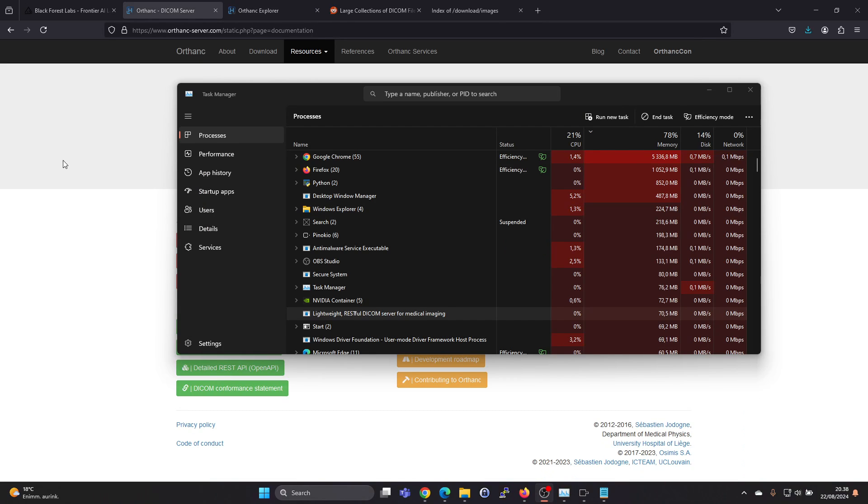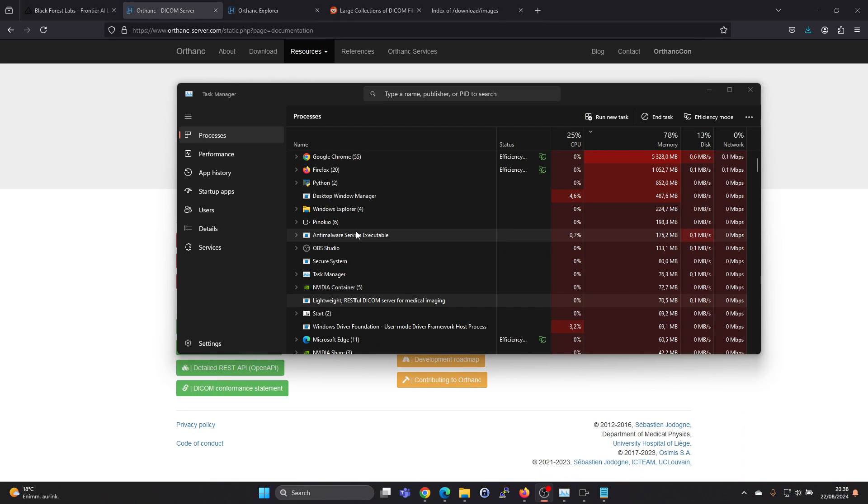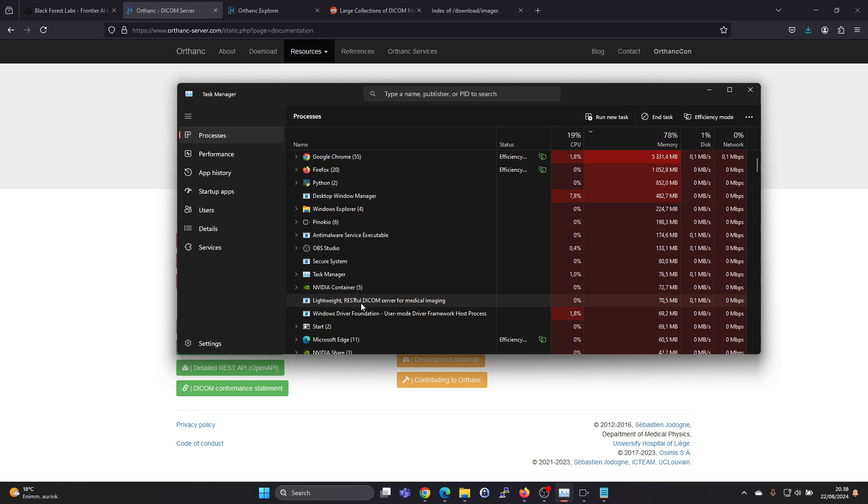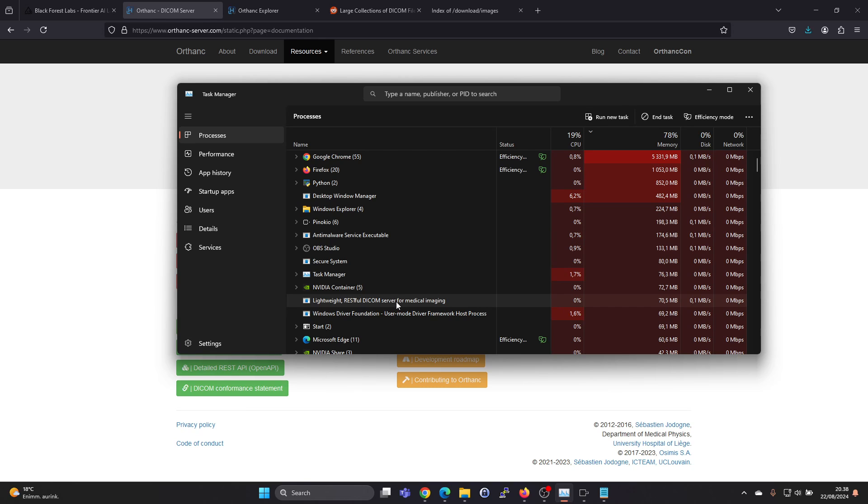After the installation completes, you don't really see anything happening. But if you check in the task manager, you will see lightweight RESTful DICOM server for medical imaging running. This takes up 70 megabytes. So this is the Orthanc DICOM server's service.